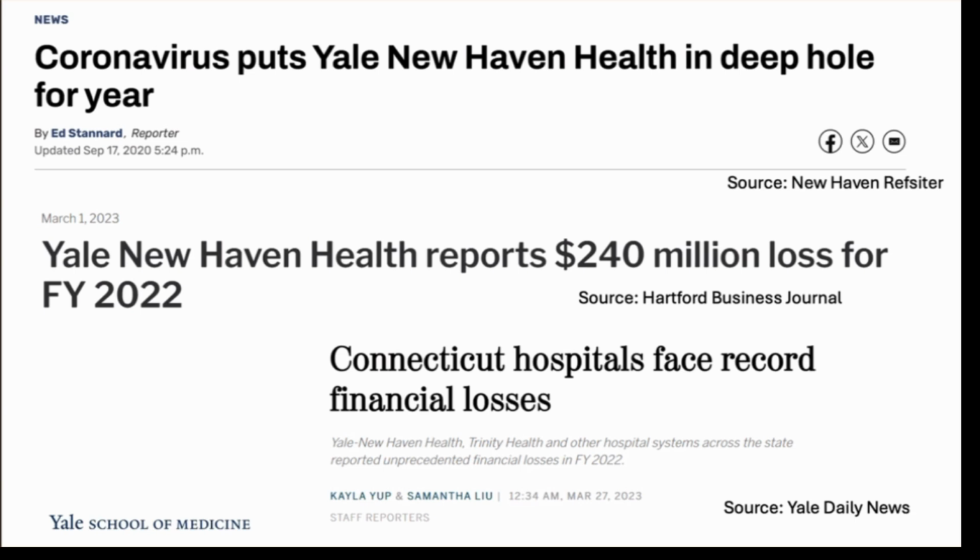Now, there are some who have argued, and Dr. David Klimstra, who was chair at MSK and is now faculty here, is one of them. They have argued that when it comes to digital pathology, it's really good to be either all or none. And their rationale is, if you do a hybrid system where you have some analog and some digital workflows, you carry inefficiencies of both. So not only are you filing physical slides, paying for the personnel, paying for the storage, you're also paying for the digital operations.